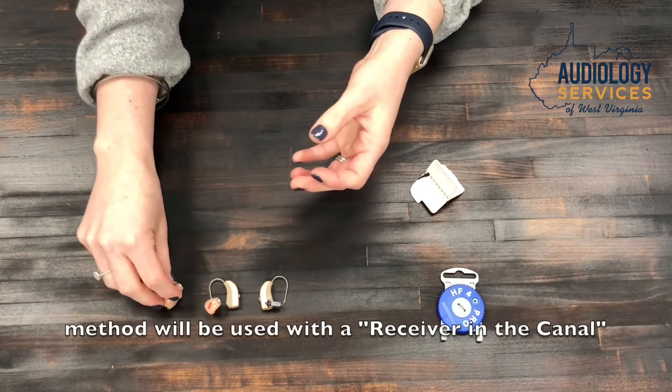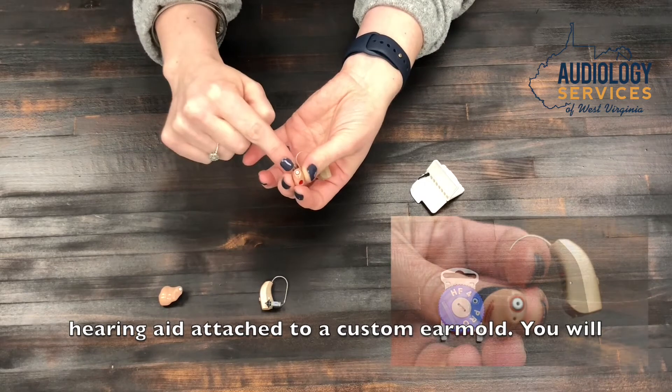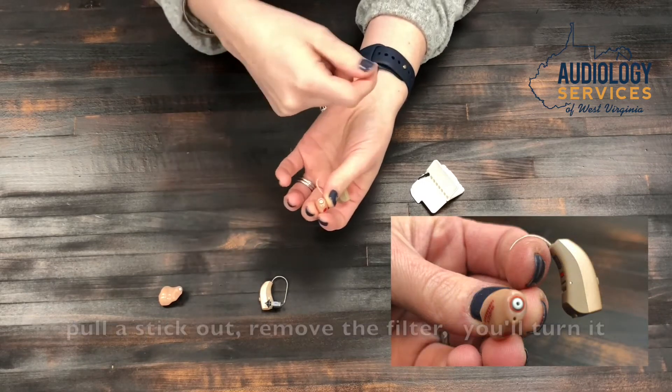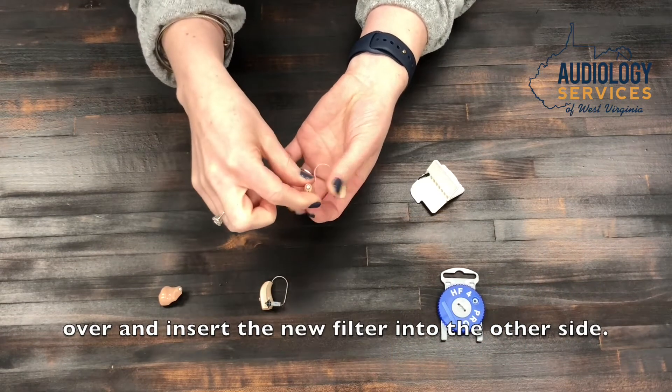The same method is used with a receiver-in-the-canal hearing aid attached to a custom ear mold. Pull a stick out, remove the old filter with the blank end, then turn it over and insert the new filter on the other side.